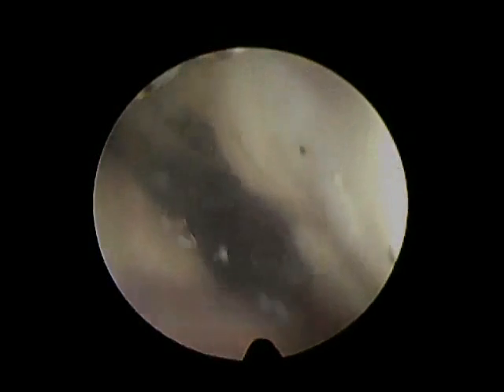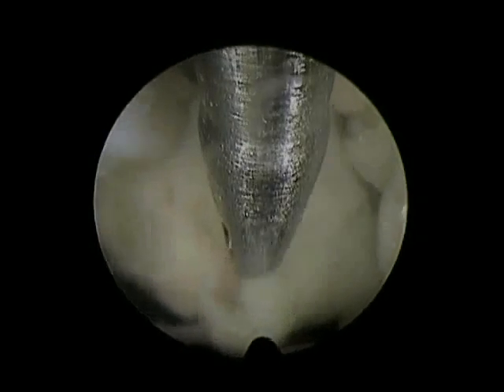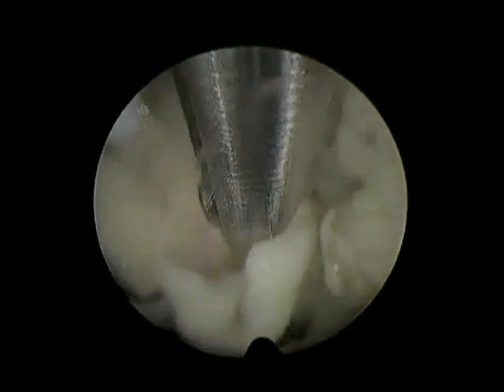Here's the inside of the chicken's belly. I'm examining and trying to see the cavity. There, here I was trying to use the scissors. I was cutting a piece of fat just to get used to the scissors. It was my first simulation exercise on a chicken. I was just having fun cutting things.